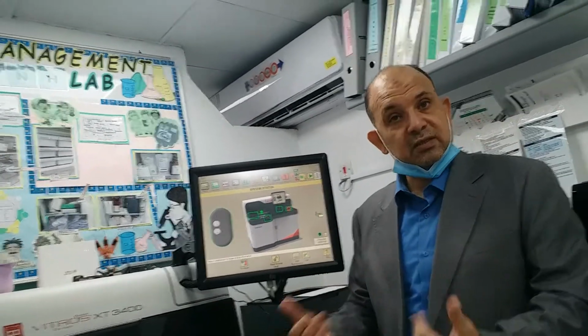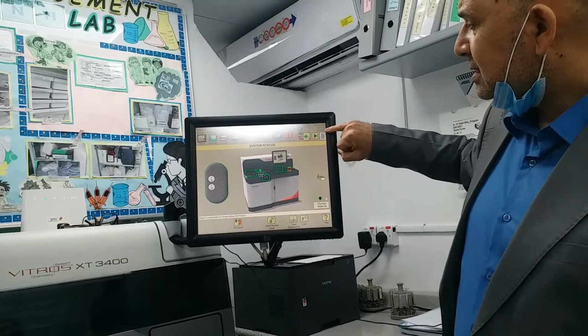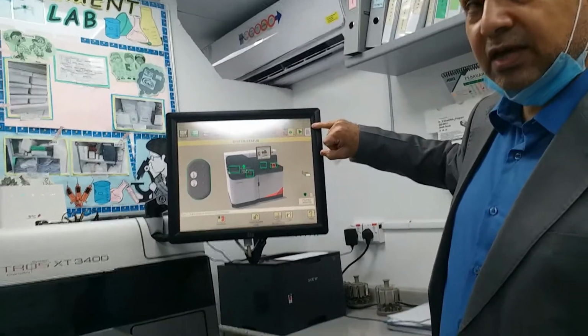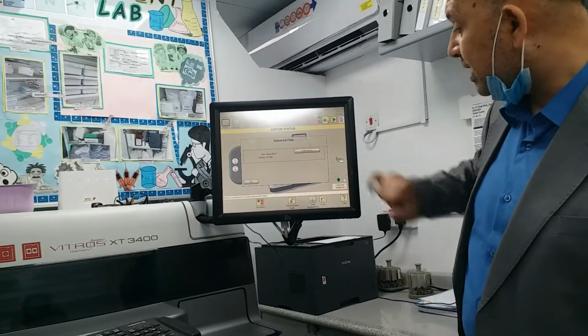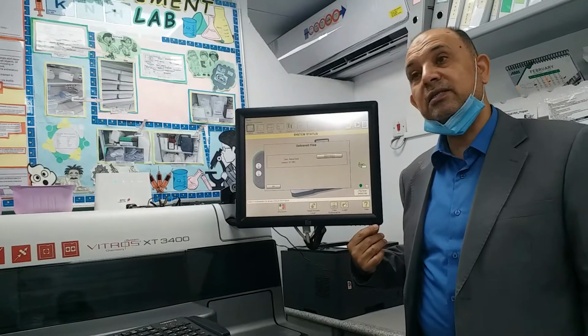How to update it? This is our point. First of all, I have to go here and look at that one, 609401. So I go to the inbox. Then now I have the version which is 611801.